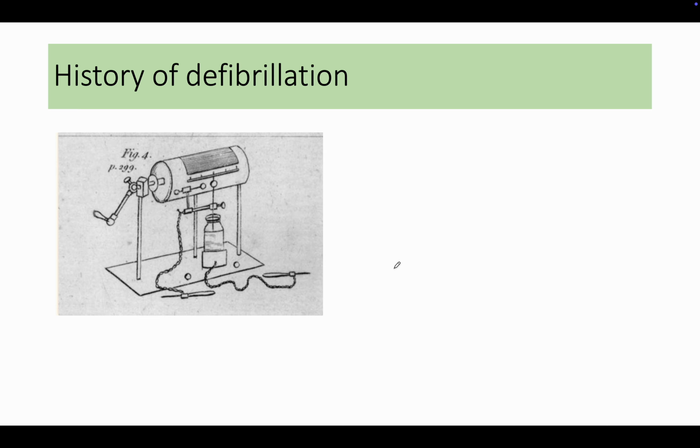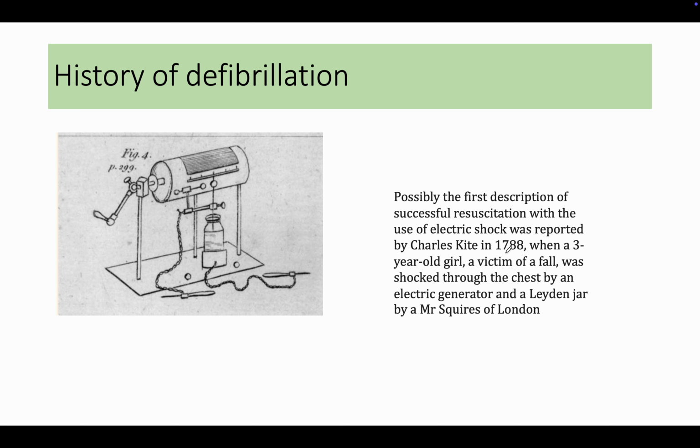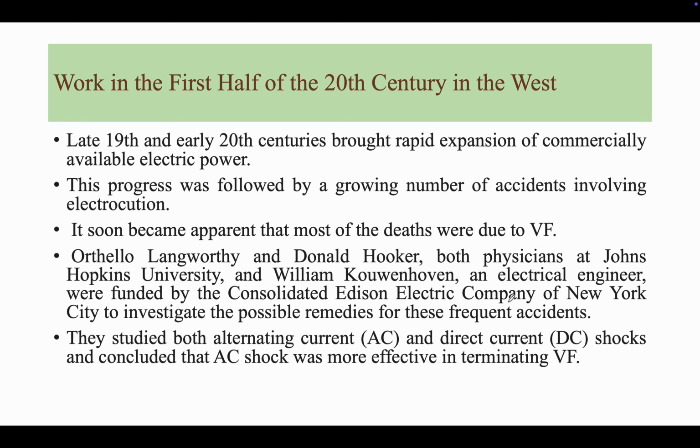Moving on to the history of defibrillation. This is the first defibrillator that has been used. It was used in 1788 in London, when a 3-year-old girl, a victim of a fall, was shocked through the chest by an electrical generator. This is of historical importance only.